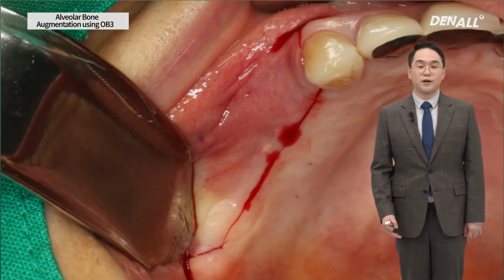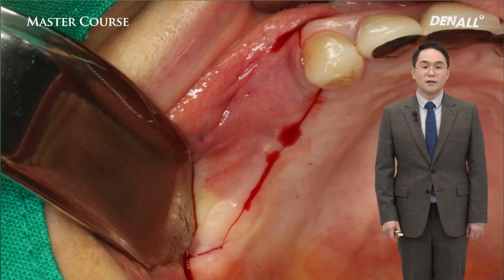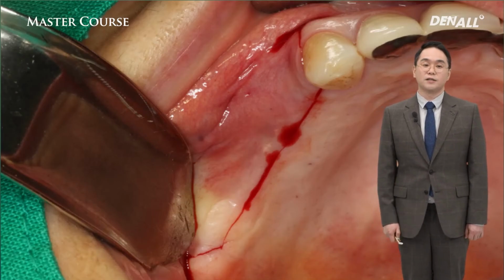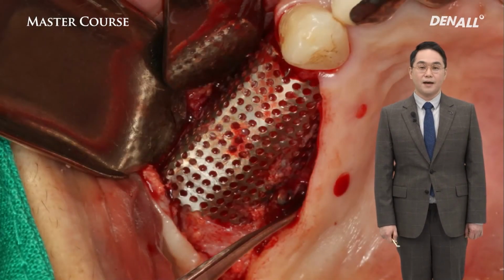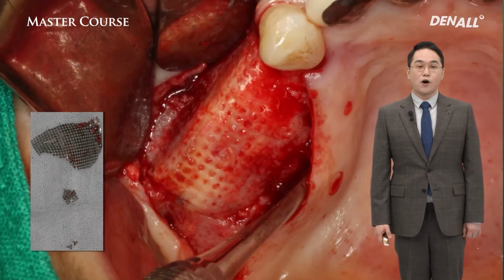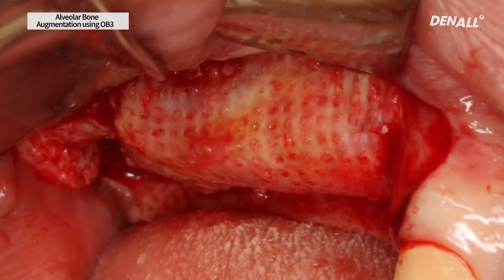Unlike the Jawbuilder removal, titanium mesh needs to be removed by making 2 large vertical incisions because the screw used to fix the titanium mesh is apically positioned, so the incisions should be made just like the first operation. The flap is dissected, 2 screws are removed, and the titanium mesh is removed. You can see bone is regenerated. The lateral view, the titanium mesh is bent. The vertical and horizontal bone is augmented according to the contour of the mesh.